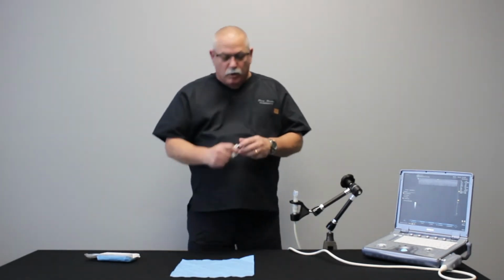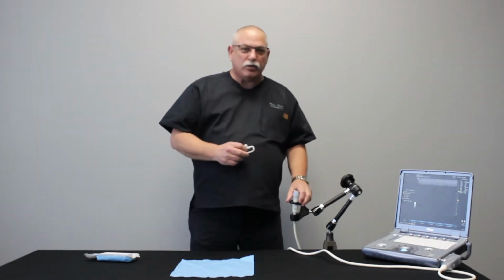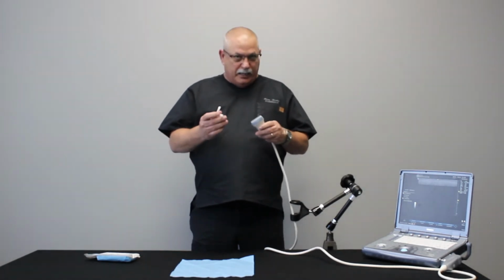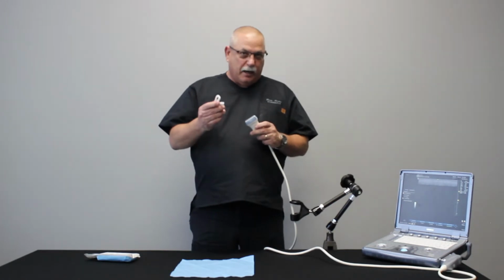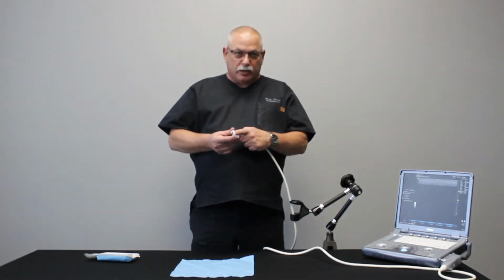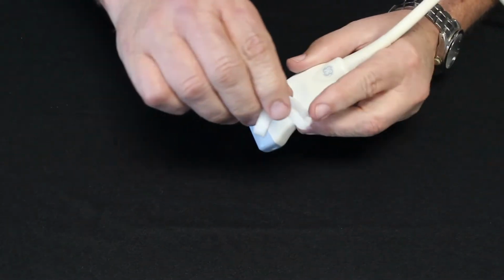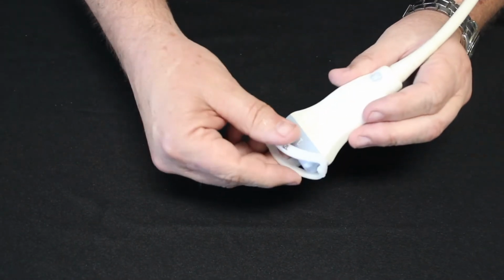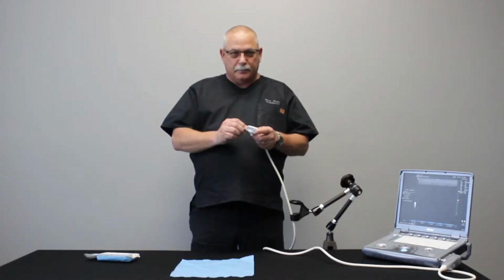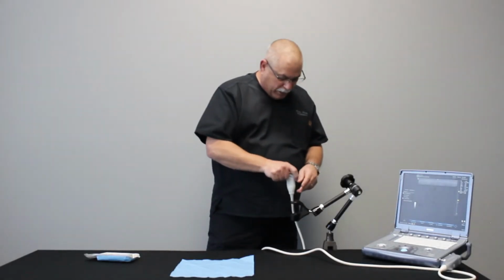So first, we're going to attach a reusable, non-sterile bracket. Now, each probe has a unique bracket designed for it. There are locating features on the bracket as well as on the probe. So we'll line those two up, and then the bracket will snap into place. I'll put it back in the holder for now.